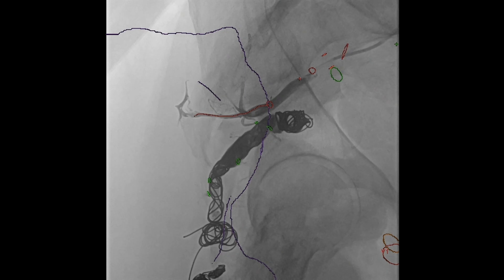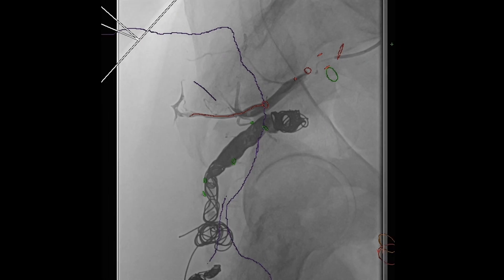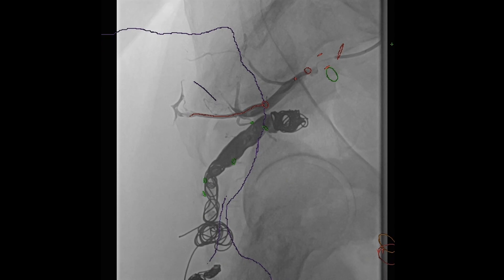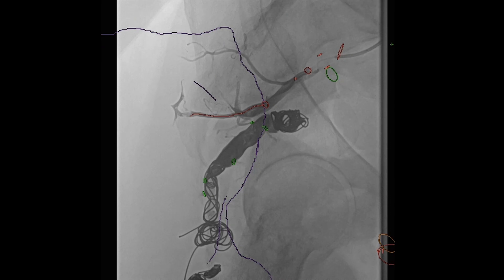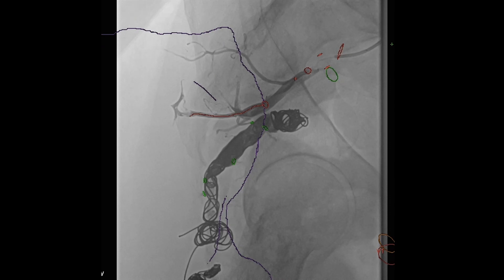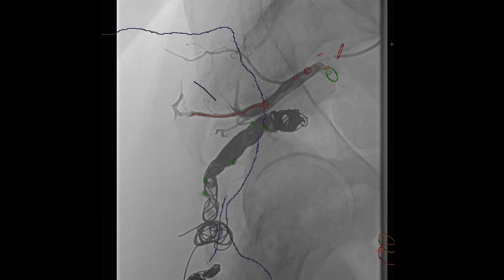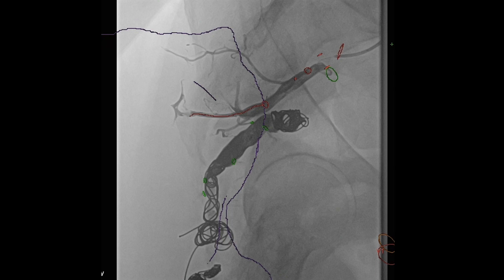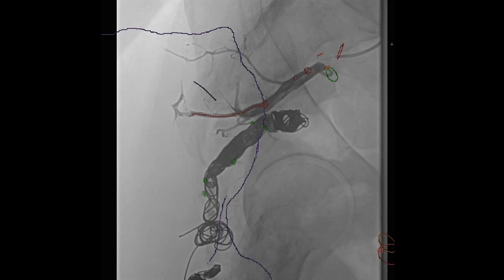The other feeding vessels were coming off the profunda femoris and running backwards up into the buttock. There had been previous embolization of branches of the profunda, which clearly did not completely devascularize the lesion. The underlying diagnosis is always hard to be absolutely certain of — I presume this is some variant of arteriovenous malformation, though concurrent large pelvic aneurysm is unusual.